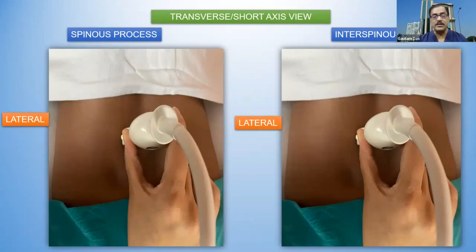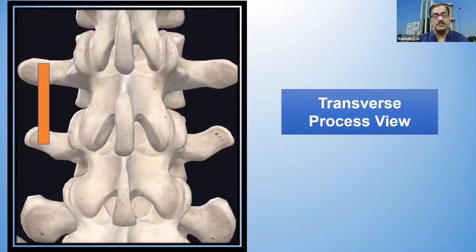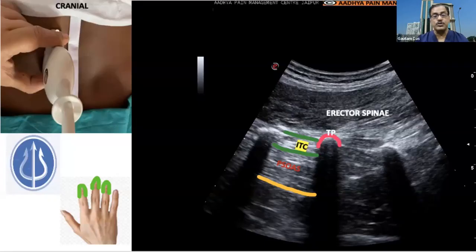And apart from that, not exactly in the midline, if we go a little bit lateral to the midline, we'll be able to see other structures as well. So we'll be demonstrating the identification of the structures and all these things.